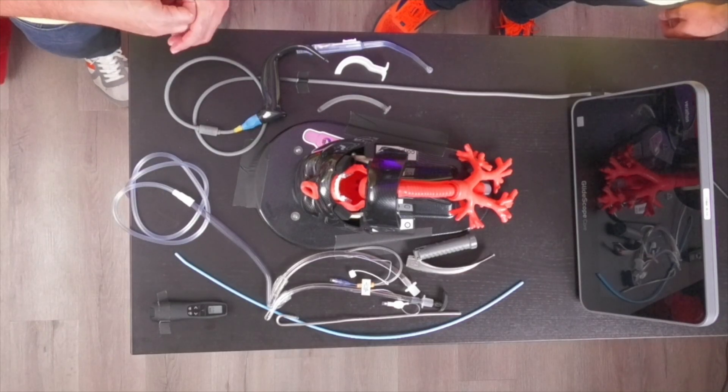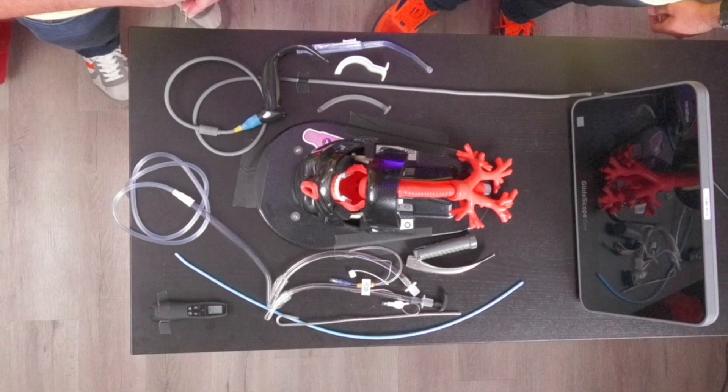What is all this mess over here? What is this stuff? Well Haney, what I'm going to be talking about now is actually how do you deal with the contaminated airway.